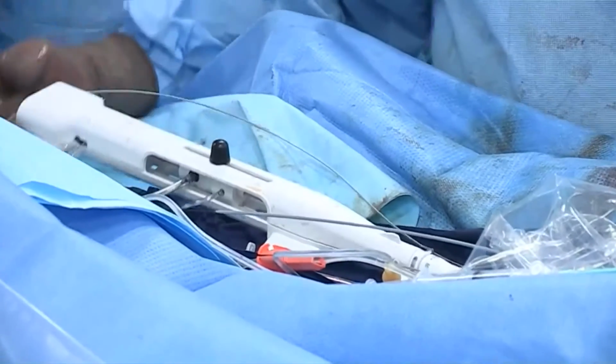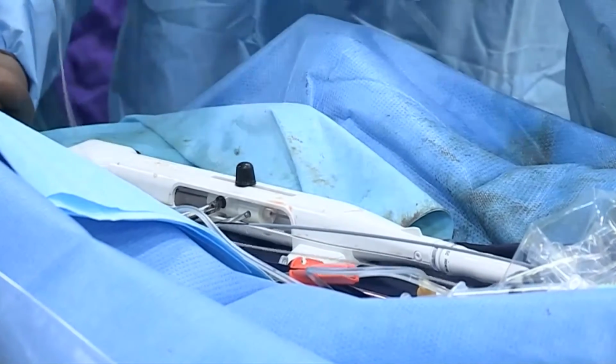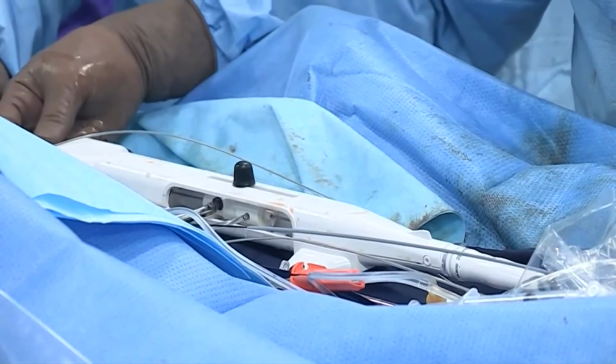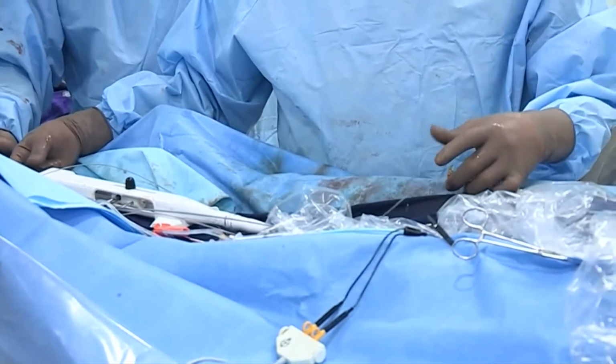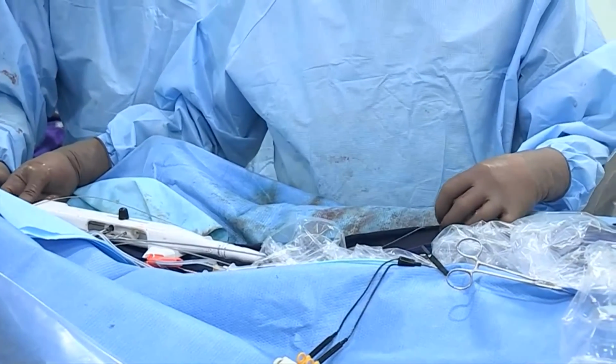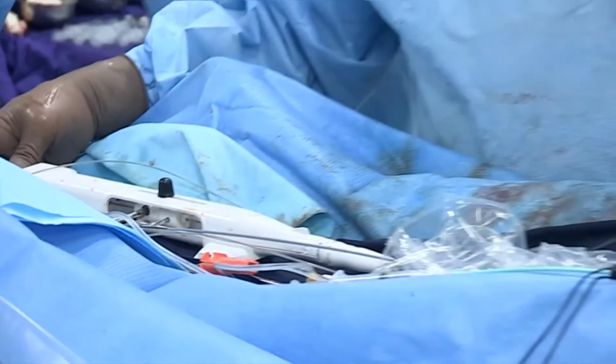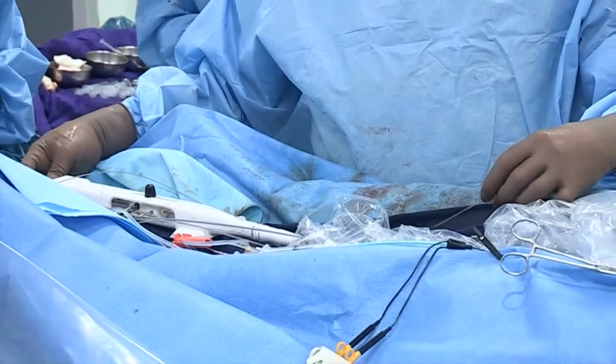My rotor is right here. I have a loop here, which is right above, sitting on me, and I have one hand here holding my Y connector, and I have my other hand right there, and I'm just guiding my burr inside. So can you see my burr is heading in? Yep. And the best part is he does not even do fluoro at this time. Yep. And no Dynaglide or anything like that.